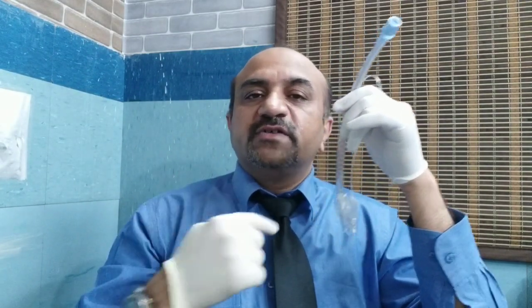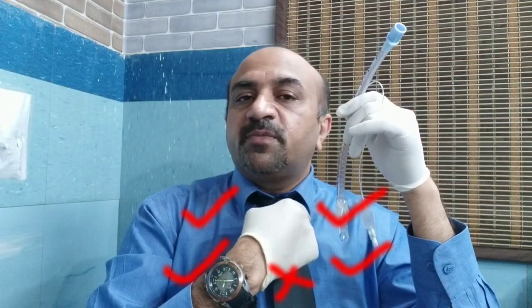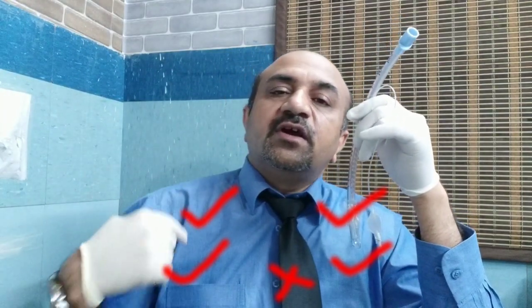Once you have passed it and you are sure that it is not below the carina, then you need to auscultate at 5 points. You can auscultate on the upper part of the right and left chest, on the lower part of the right and left chest, and in the epigastric area. You shouldn't hear any air entry in the epigastric area, but both on the right and left side.